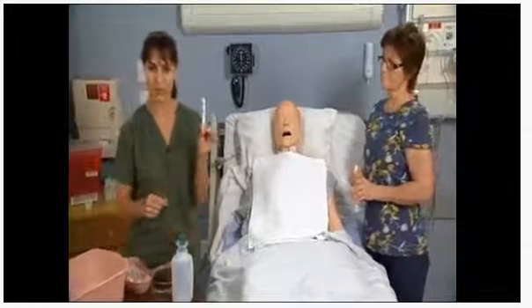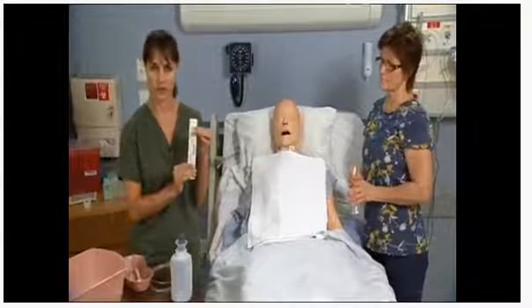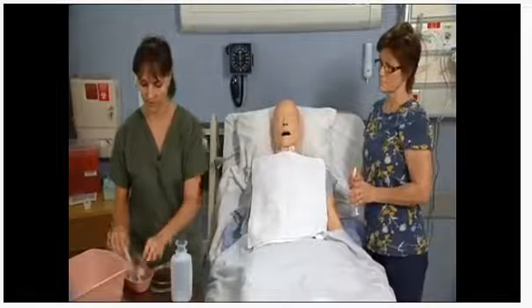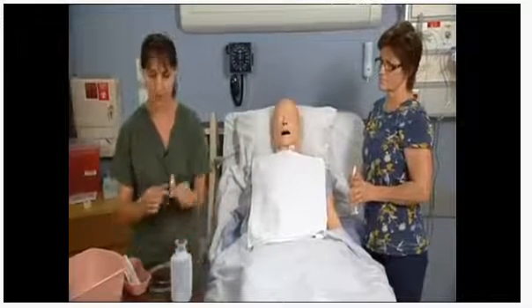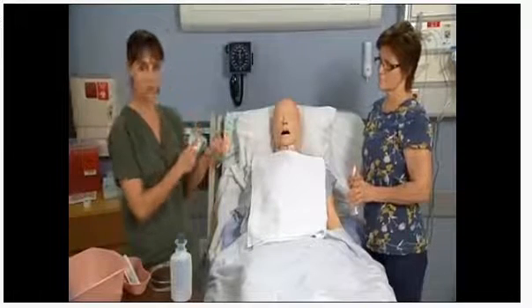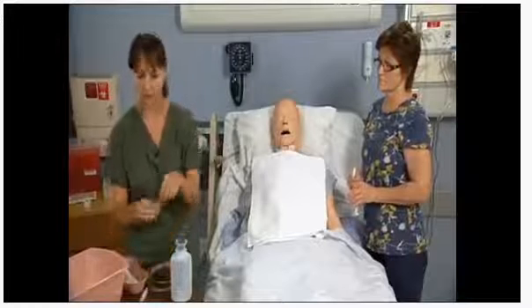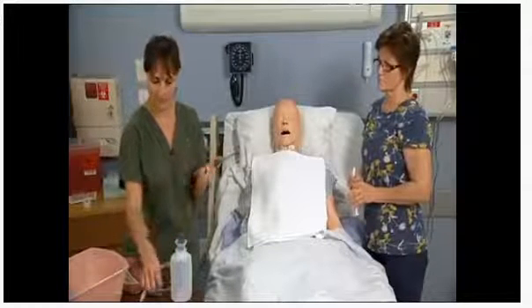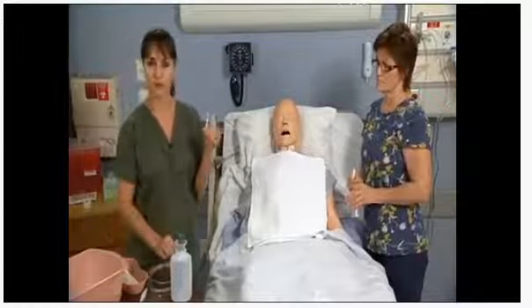I'm also going to need a pen light, a tongue depressor, tape, a connector that will connect from the NG tube to the suction canister, a safety pin, and also a pH strip.